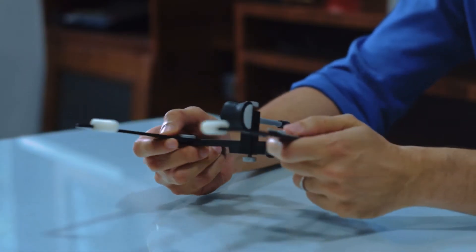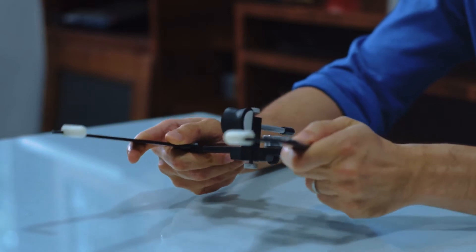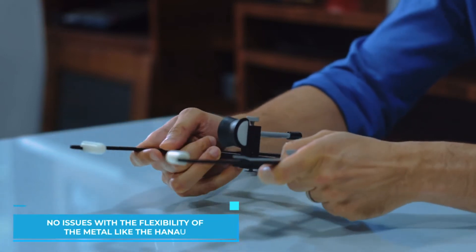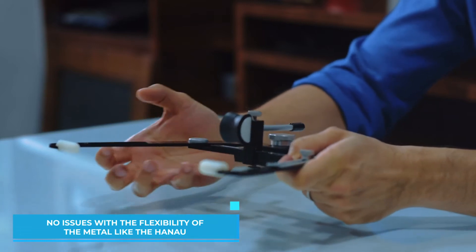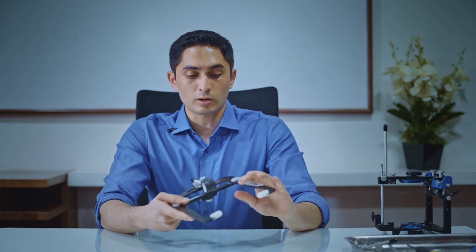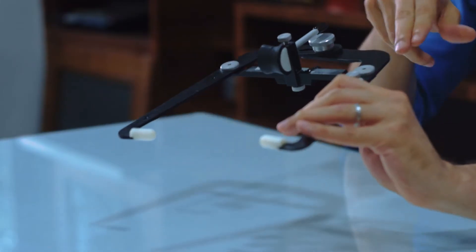Welcome to another episode of the Dental Review Guy. Today we are going to talk about the Panadent face bow. I really like this face bow — it has a really rigid construction and it's not a spring type of face bow, so you don't run into issues with the flexibility of the metal, which is something I've seen in other face bows.